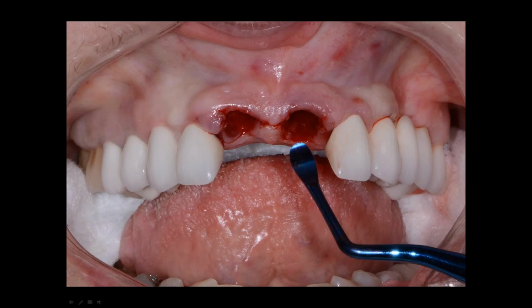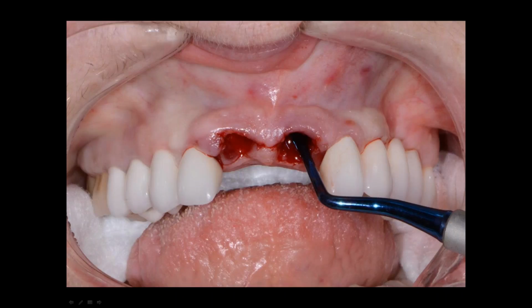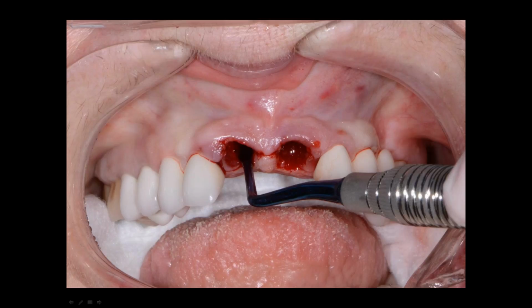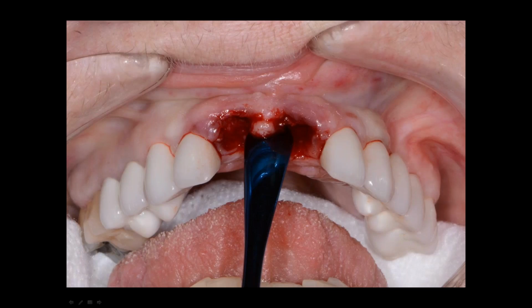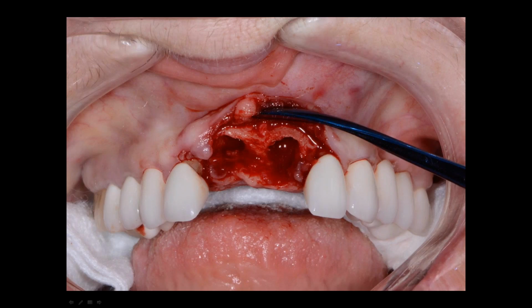That is one of the essential procedures that we implement before placing any type of grafting material into the socket. So we'll go ahead and curette. We'll initiate further bleeding and make sure that any granulation tissue is removed. At this point, we're going to reflect a flap so that our viewers can see that the buccal plate is fully intact. So we're using these instruments from the Golden Dental Solutions grafting kit. And here we can see, utilizing the separators and the physics forceps, we were in fact able to remove the teeth atraumatically without breaking the buccal plate.